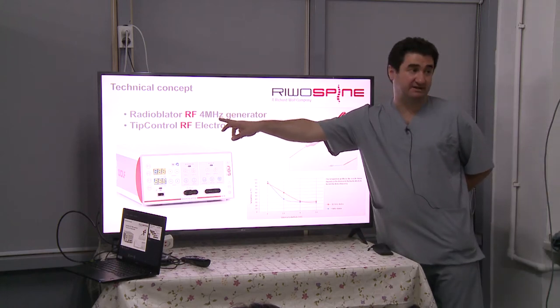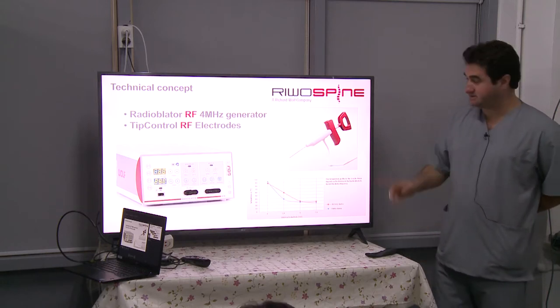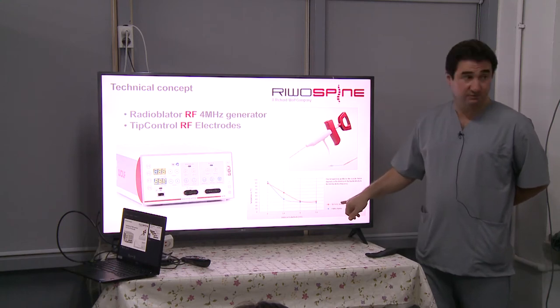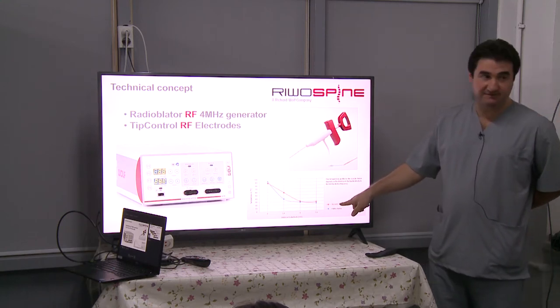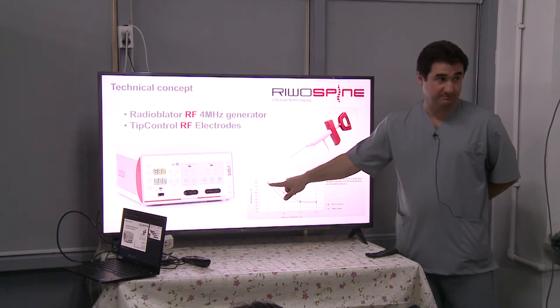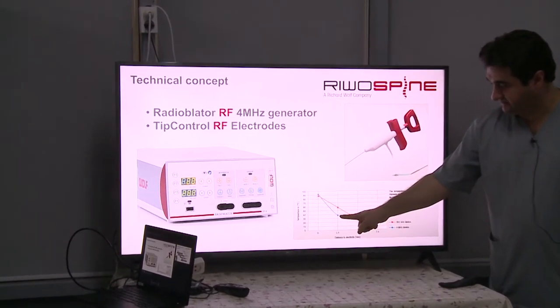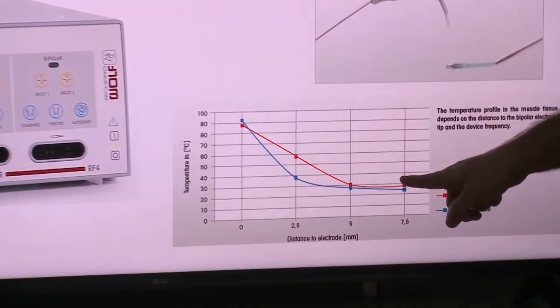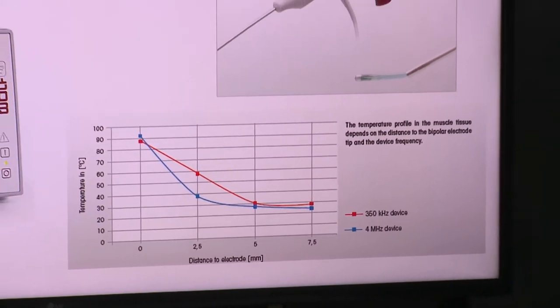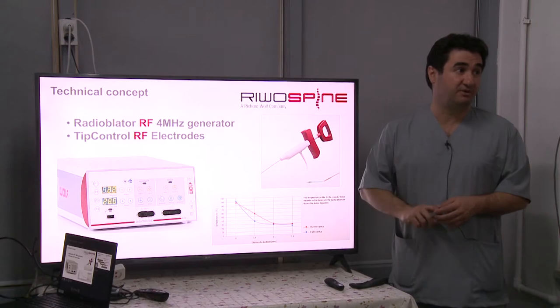And we work with 4 megahertz now. Working with the high frequency is really important for us because we did a study here. We compared the high frequency with the conventional ones, which are 350 kilohertz. On the tip, the heat is the same. But when you go a little bit around, like 2.5 millimeter, you see the heat goes down by half with the radio frequency, but with the conventional one, it is still really high. That's why you cannot work very close to the structures with the conventional bipolars. You have to use the high frequency bipolar to work very close.